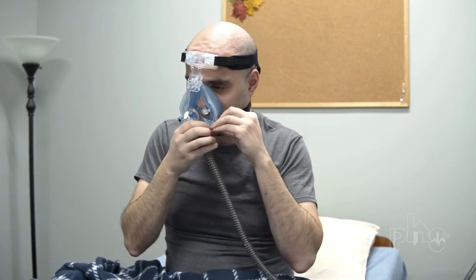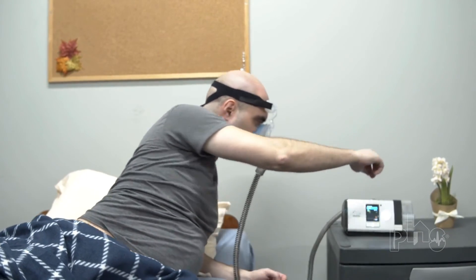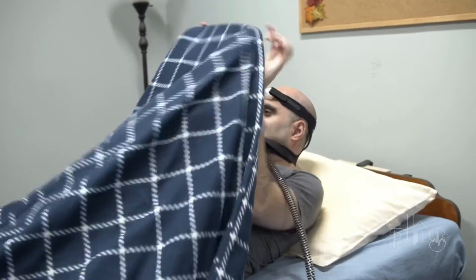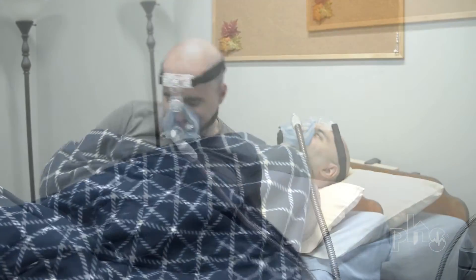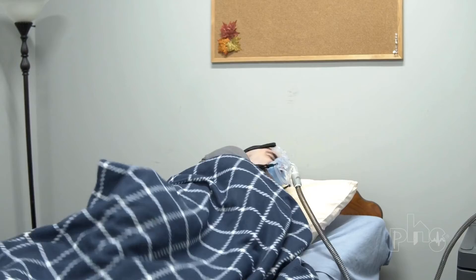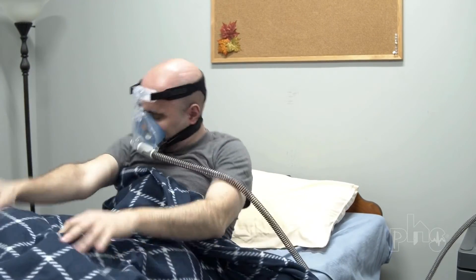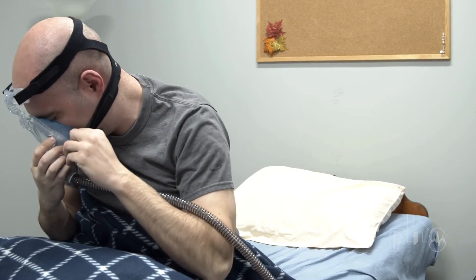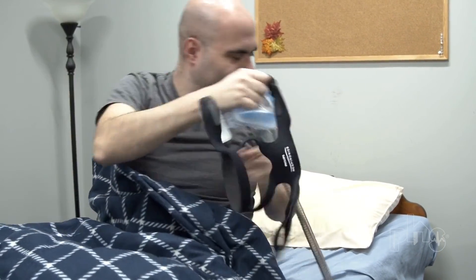Full face masks cover both the nose and mouth. They are a good choice if the patient breathes excessively from their mouth or is awakened by air from the machine leaking into their mouth. To use a full face mask safely, the patient must be able to remove the mask on their own or have a caregiver monitoring them during use in case of vomiting or equipment failure.